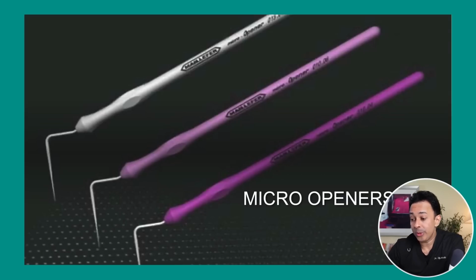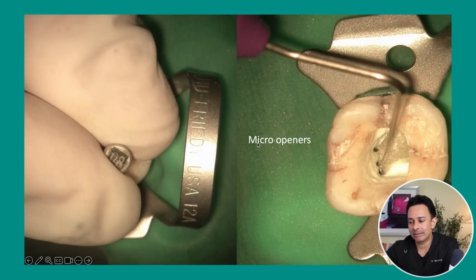The other good tool you can have in your armamentarium is something called micro openers. These are just files attached to a handle. So many times when you work in hard-to-reach areas and you're looking at locating a missed MB2, then you want visibility. So if you're using your hand to hold a file, then the hand often blocks visibility. So if you have something called a micro opener, which is actually files attached to a handle, then your visibility and accessibility improve. So it's much easier to work when you're looking for, say, that catch or that initial entry.